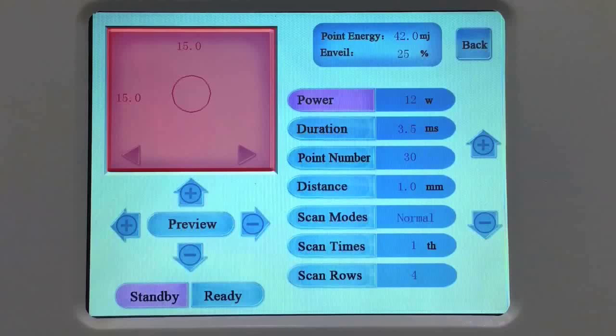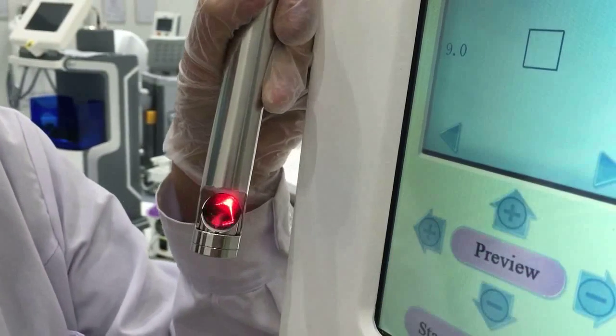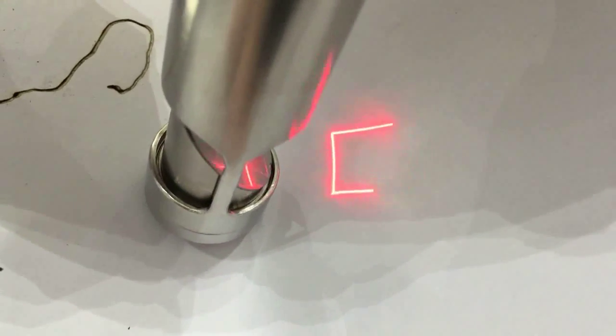There are seven shapes available to choose — touch preview. There are: line, square, rectangle, triangle, hexagon, round, oval. Size is adjustable. Save it for treatment. Save the setting parameters. Touch the start button, at the same time step on the pedal, and the machine will start work.